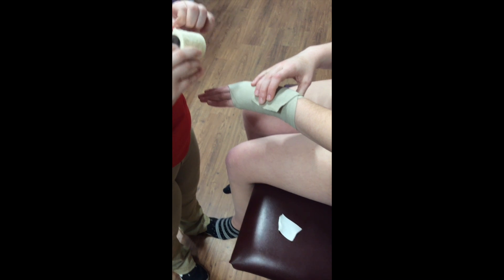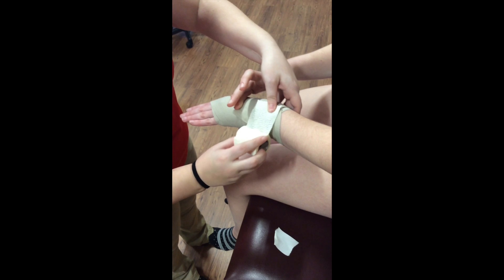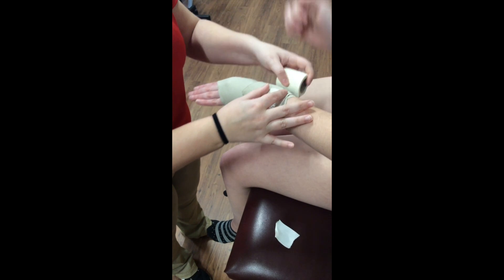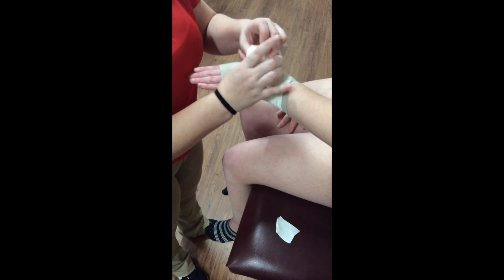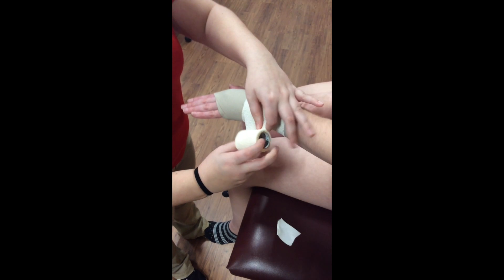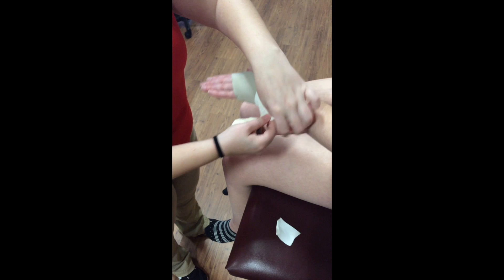She then applies one and a half elastic tape around the proximal wrist. She makes sure that the tape job is neat and functional, and then the athletic training student verbally explains when to discontinue use.